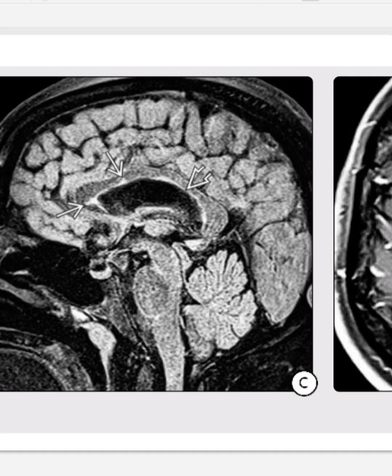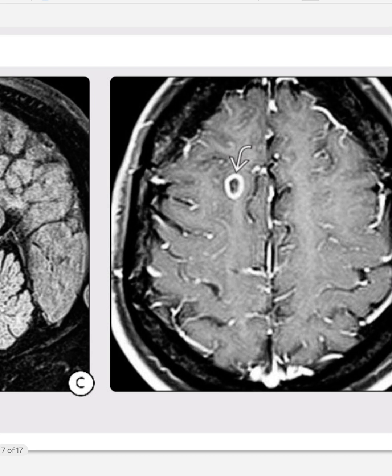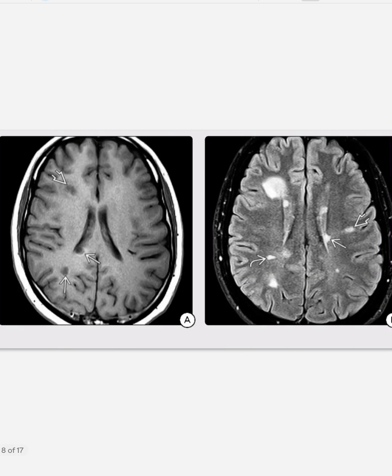On the sagittal FLAIR imaging, we can appreciate several triangular-shaped hyperintensities at the callosal-septal interface. A dot-and-dash appearance can be appreciated along the ventricles. In the same case, a solitary ring-enhancing lesion is present. The imaging can satisfy the revised McDonald criteria, which will be discussed in coming slides.